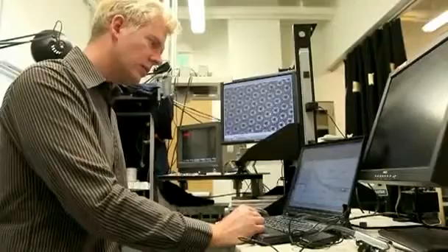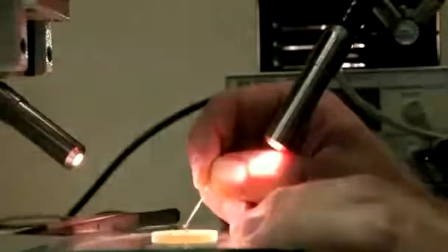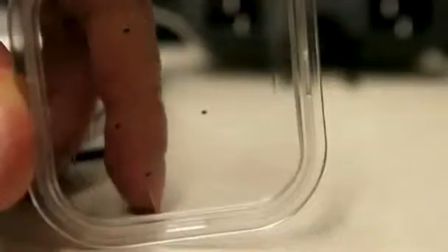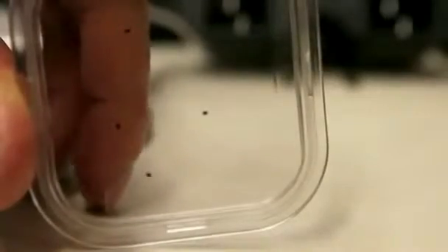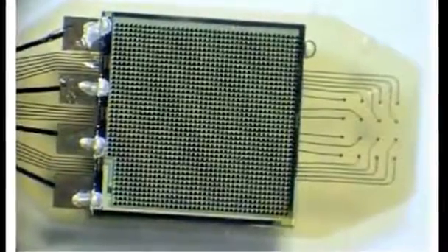For the past 5 years, Jim Loudon has been designing a tiny photovoltaic chip. It's only 1/3 the width of a single human hair, but he says that one day its impact on people with degenerative blindness will be enormous. The chip is part of a retinal prosthesis system being developed at Stanford University. A retinal prosthesis goes in and tries to actually restore the light sensing ability to these areas of the retina that no longer have that.